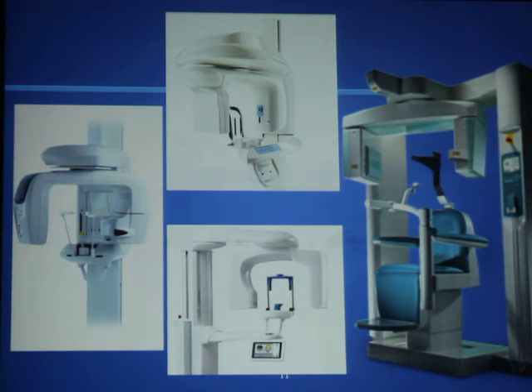So now, cone beam is a big machine. It looks like a panoramic machine, and different companies make it. You know, in some machines patients sit, and the other machines patients stand, but it does not look any different than a panoramic machine.